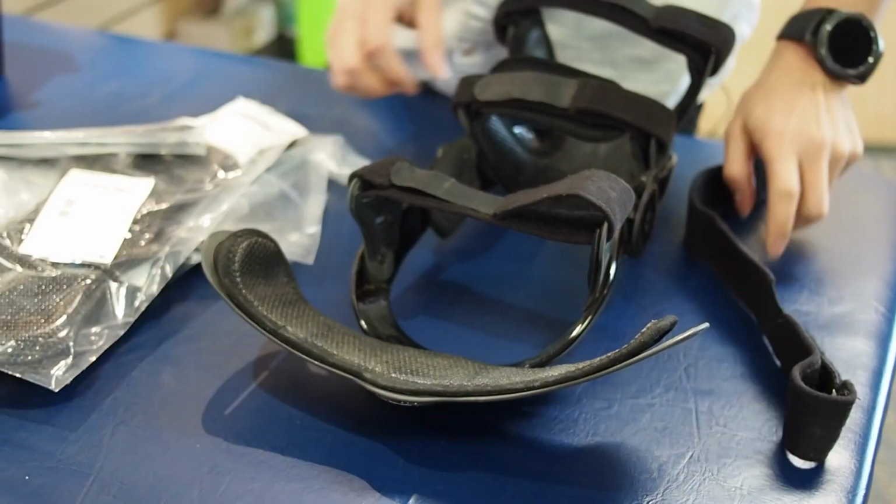You can do this yourself, but I do recommend that you take it into the brace tech and they can do it for you.